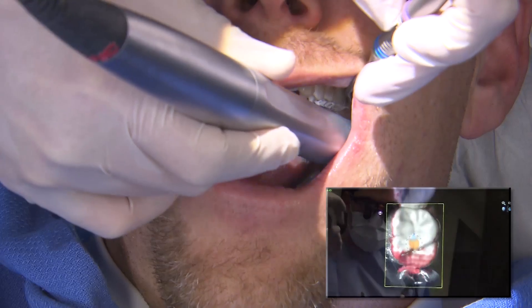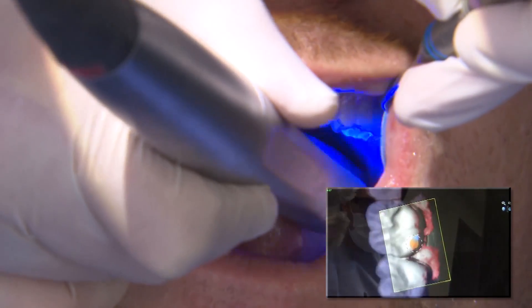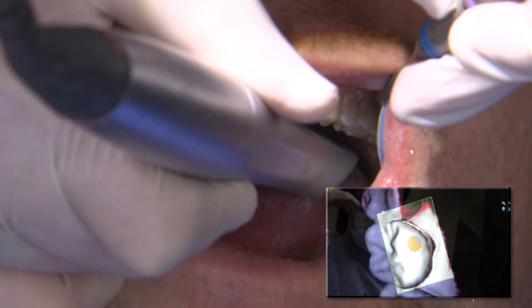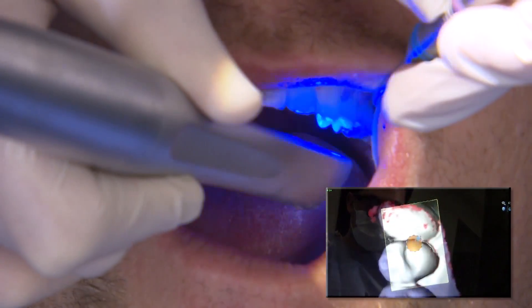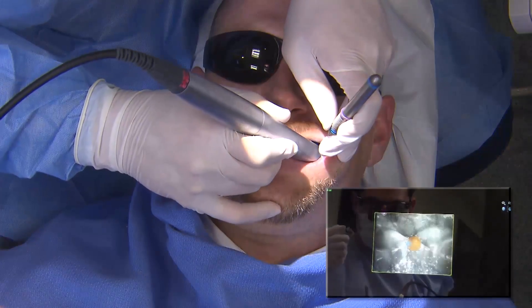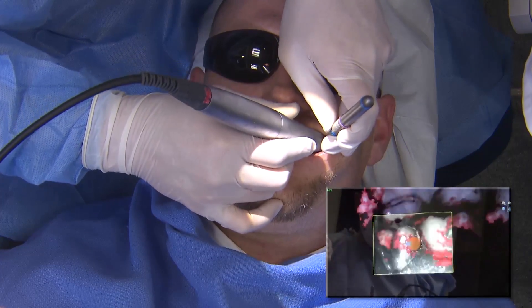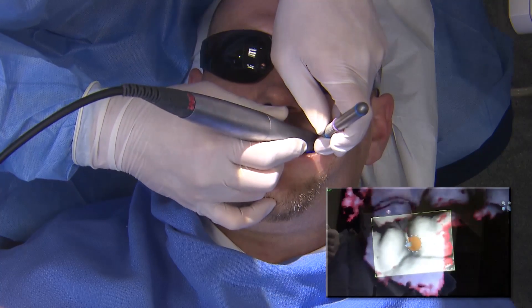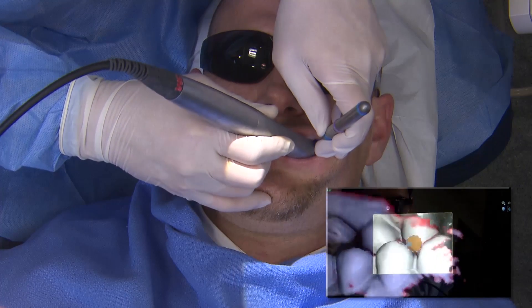Then I capture the opposing scans — the entire upper left quadrant, the occlusal surfaces, lingual surfaces, the functional areas, and the buccal surface, which is important for the third set of scans: the buccal bite, where the patient bites down all the way. It's also helpful to capture the gingival margins for the preparation and opposing scans to merge those together.